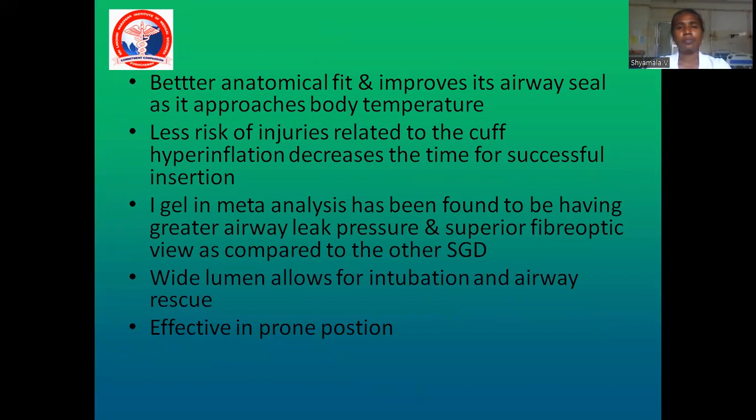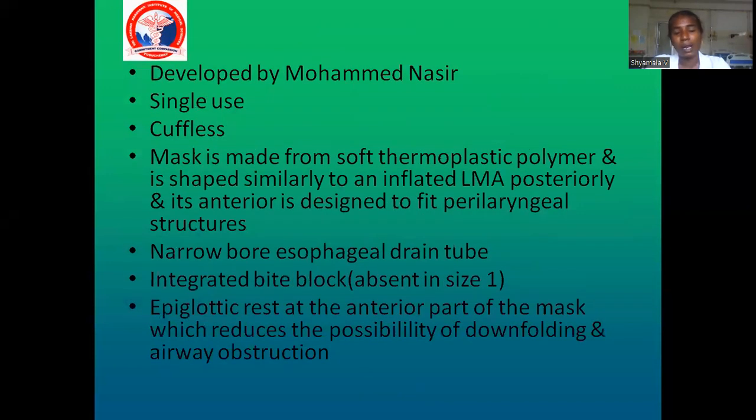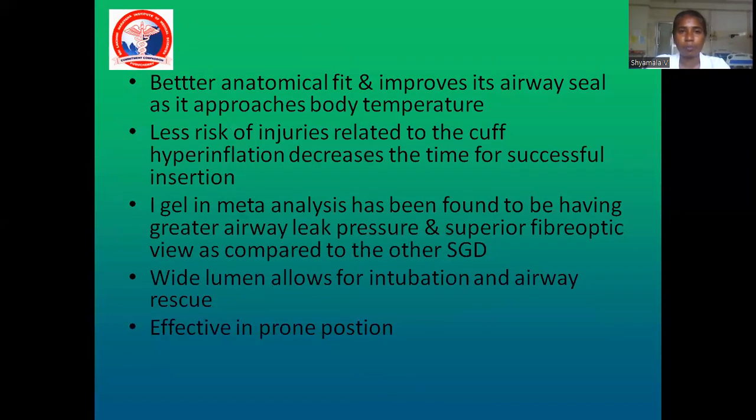It has better anatomical fitness and improves airway sealing as it approaches body temperature. The main thing is, it is made of a thermoplastic polymer. According to the body temperature, the thermoplastic swells and fits into the anatomy. It has less risk of injury related to the cuff.